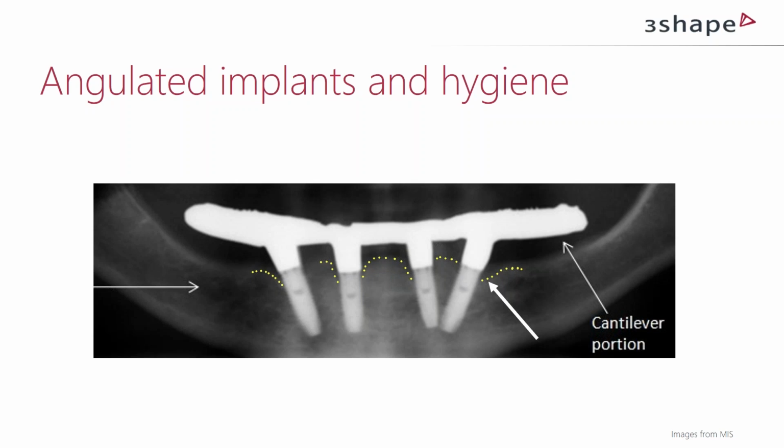So there are so many variables, and what it boils down to is how we build up a routine and a practice for ourselves. Using digital tools and better implant planning software, which takes in more information from CBCT scanners and intraoral scans, is definitely a way of building this routine, and even once you have the routine, a way of improving your existing skills. So that's definitely a follow-up and call to action to everybody out there: we're going to make a follow-up webinar on seeing this live in the software.